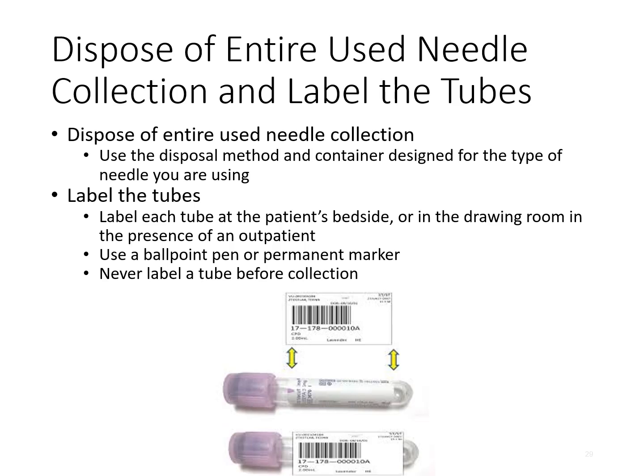You're going to label the tubes at the patient's bedside before they leave. Use a ballpoint pen or a permanent marker to identify what time you drew the sample, and usually your initials too, to indicate that it was you who drew it. You're never going to label the tube before you collect from a patient. So do not leave the room without labeling the tubes, and don't let the patient leave the room without labeling the tubes either.